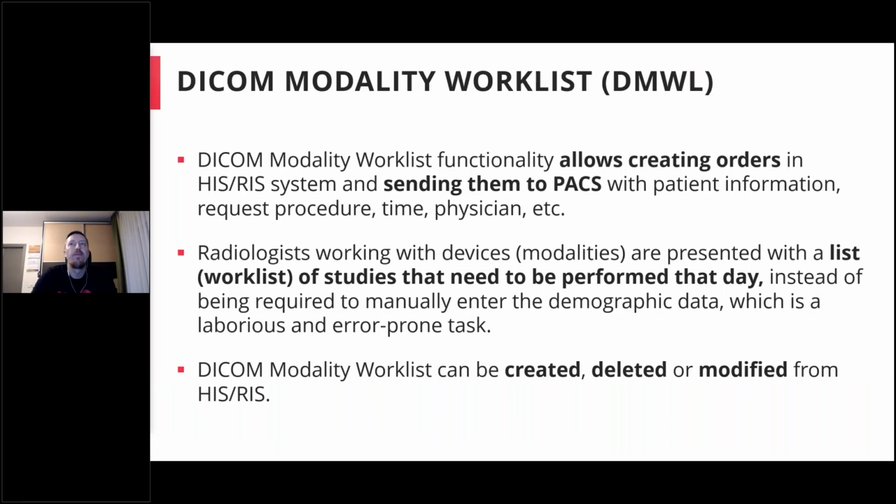For those who don't know what this DICOM modality worklist is, basically this functionality allows creating orders, usually in a hospital information system or radiology information system, and sending these orders to the PACS or server with the patient information, requested procedure descriptions, time of the scheduled procedure, physician name, requesting physician, and so on.